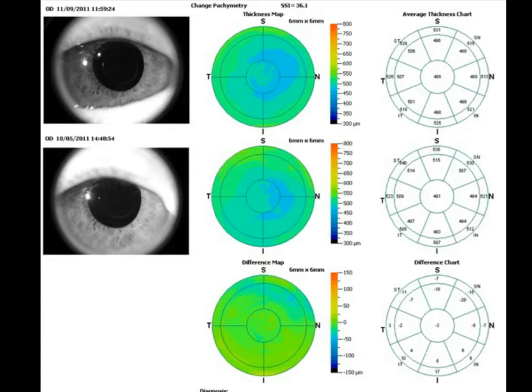Not surprisingly, you're seeing the corneal thinning occurring more so superiorly, which is that portion that's underneath the eyelid, which is just challenged more from hypoxic conditions in those patients with Fuchs endothelial dystrophy. Again, the lid is covering that up. There's more oxygen demand there, so you would expect that when you put Muro 128 on those corneas, you see more of a response on that superior portion.